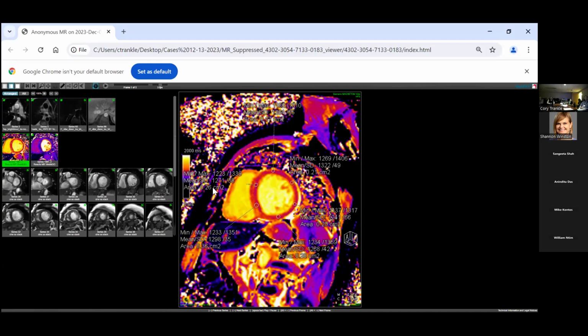So one of the reasons that it's in color is, look at the scale. Remember the T1, we have 0, and it goes all the way up to 2000. So that's 2000 increments that can happen. If you think about black and white, the images on the far left are in grayscale.